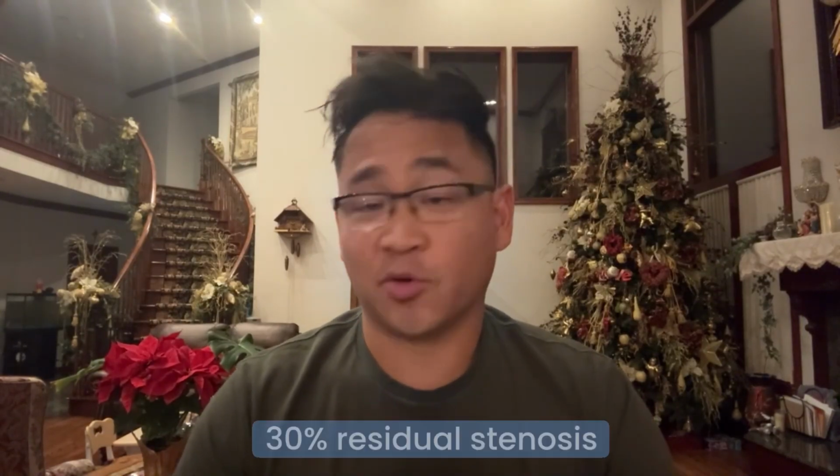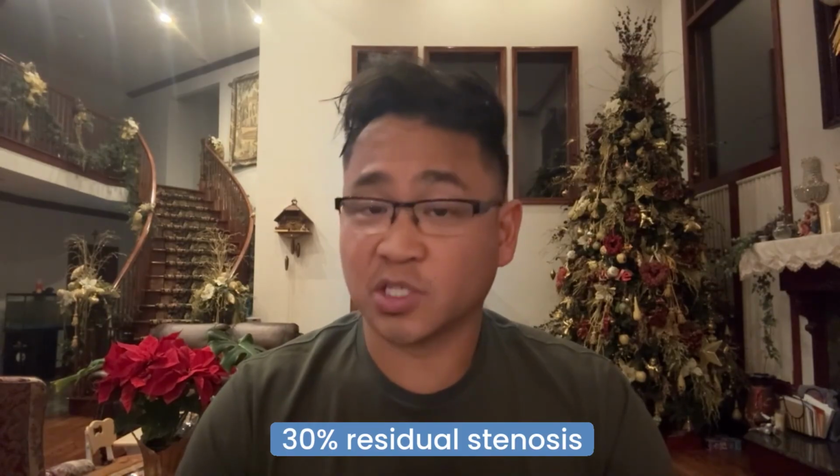And oftentimes at that point, the only reasonable alternative to treat that stenosis is to extend the length of the stent. As far as the indications go, you don't want to consider stenting until you have 30% residual stenosis that you can't treat with angioplasty alone. The stent that we would use, and of course this can vary by institution, is usually the stent graft, which means that it's a stent that's covered and self expanding. It's not one of those balloon expandable stents. And that's also good for treating complications that could occur during the fistula.